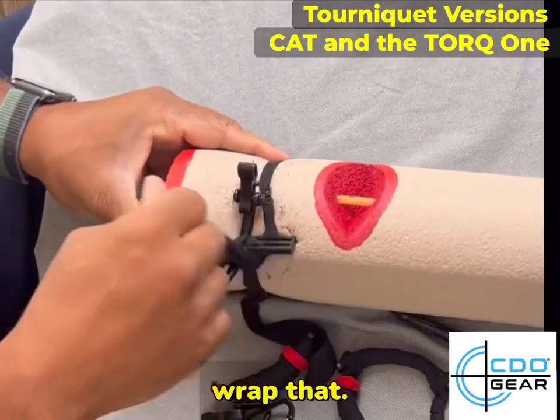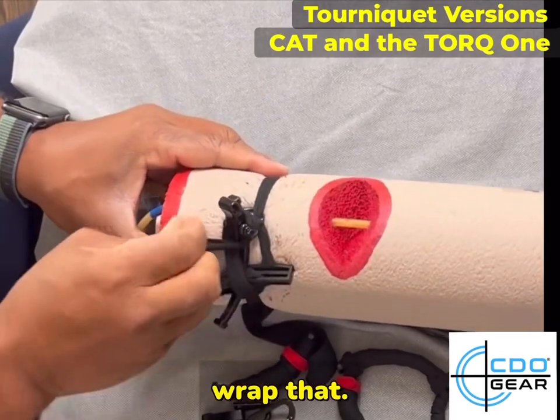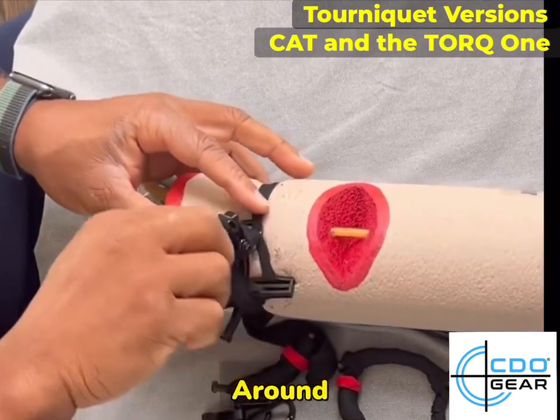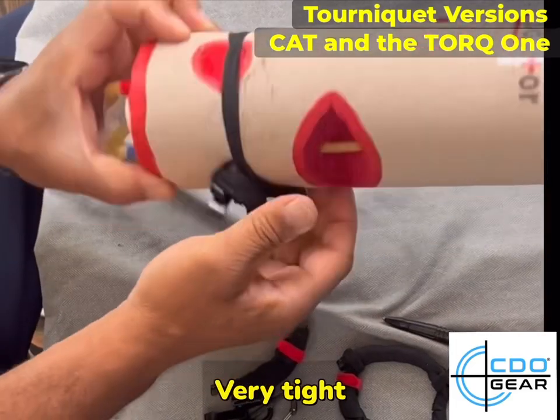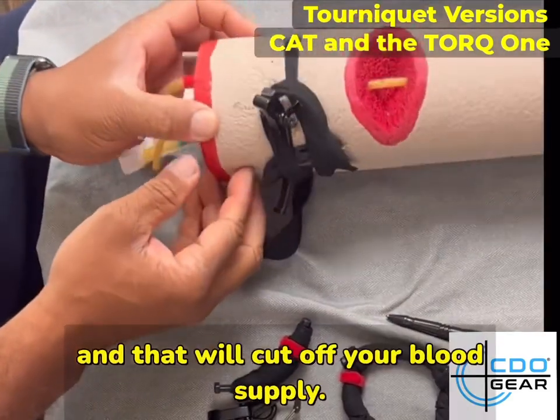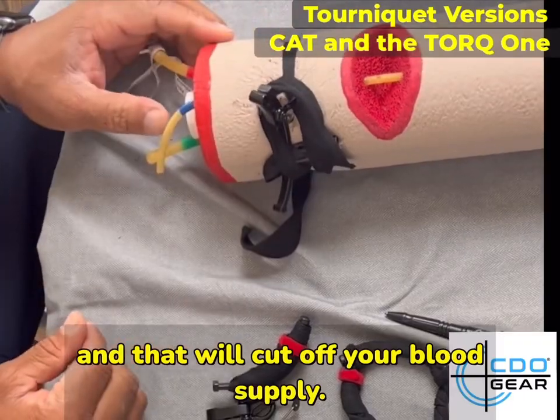Now you can wrap that around, and then you can see — very tight. And that will cut off your blood supply.